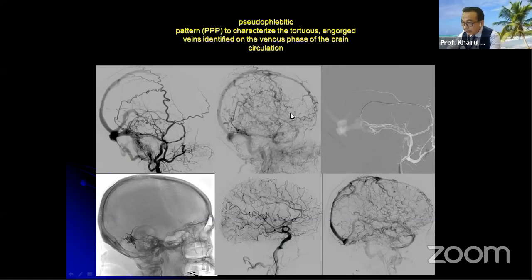We have retrograde venous reflux. We need to treat the patient to reduce venous hypertension. Of course, they have occipital and also middle meningeal feeders. Since the middle meningeal artery is in the petrosquamous bone, we can navigate our catheter as distal as possible. Then we inject, like in this case, the Onyx. This completes the treatment.